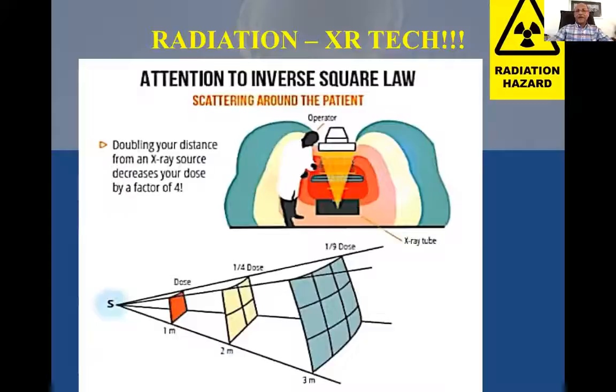So you need to understand all these. So this X-ray source distance keeps you away from the dose by a factor of 4. So you need to try to move back as far as possible, if at all possible.